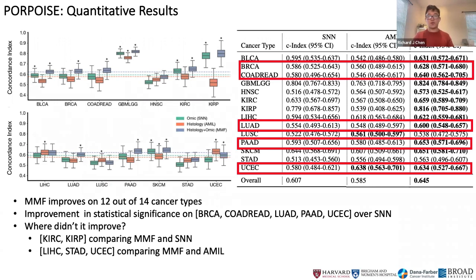How we defined statistical significance was we used a log rank test to see whether or not the model could stratify the top 50 and lower 50 percentile patients. And these were cohorts where using molecular data alone could not do patient stratification, whereas multimodal fusion was successful.